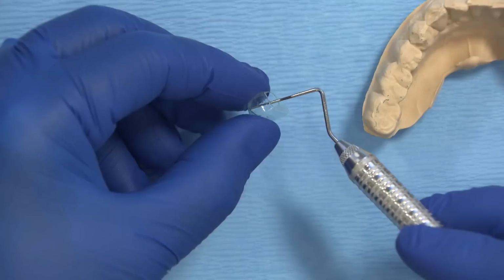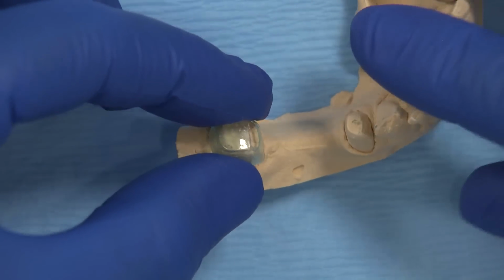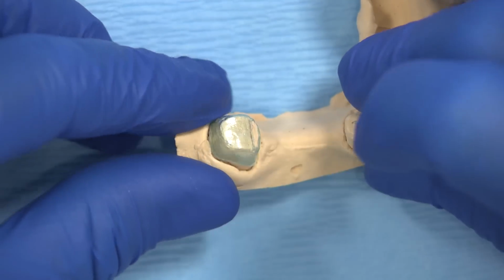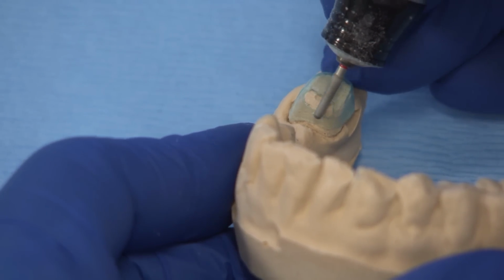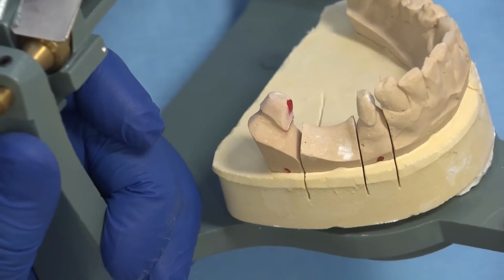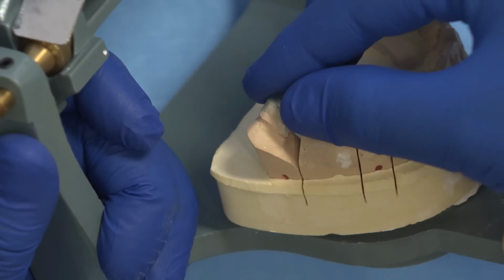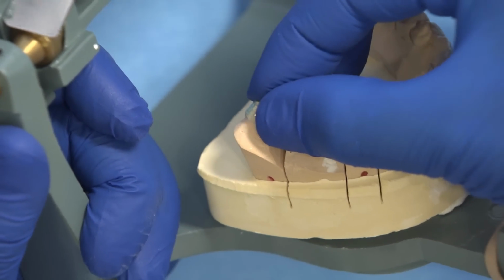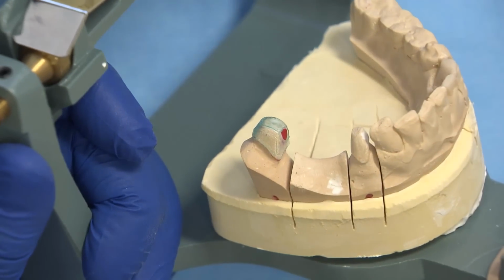So to show you this, here is the reduction coping. I'll snap it onto the prep tooth and with the taper diamond burr, I'll go across and remove the tooth structure until it's level with the edges of the coping. Then I'll be able to bring the bridge and place it on a common path of insertion. I found that this method is not always successful, especially if the undercut is located on the axial wall.